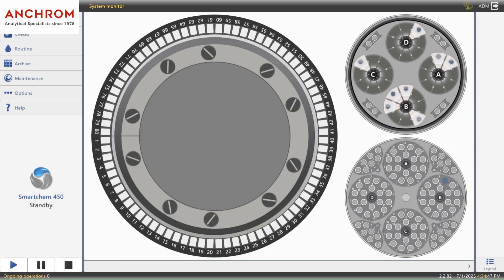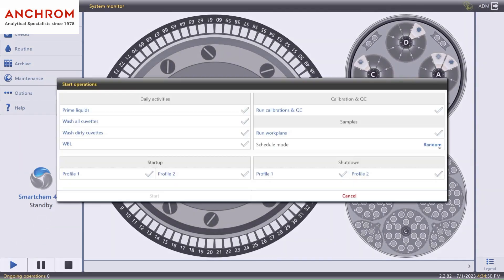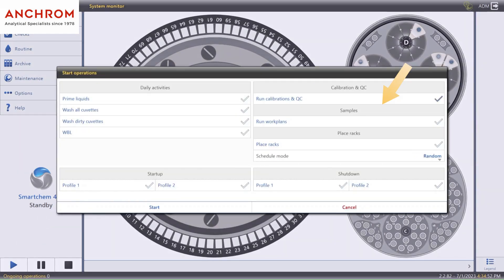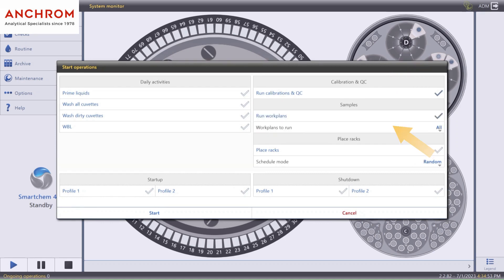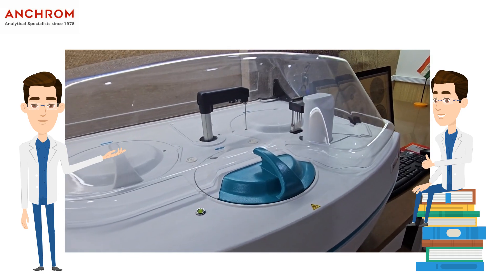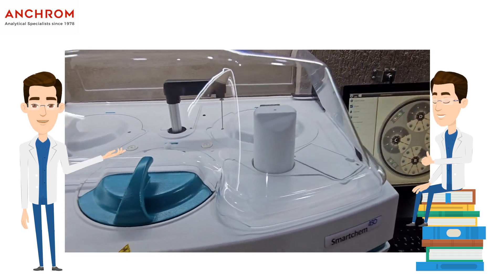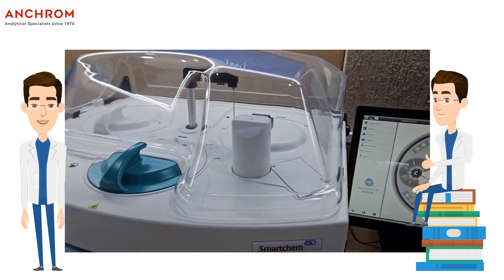With all the things in place, let's start our sample testing. Click on Run, select Run Calibration, select the work list, and click Start. Now, with the instrument doing its work, we can focus on our other lab work.